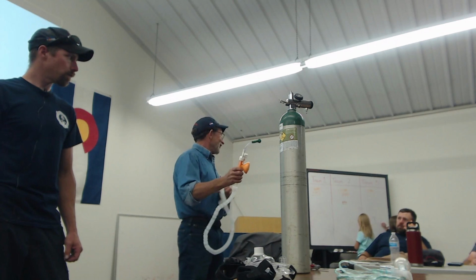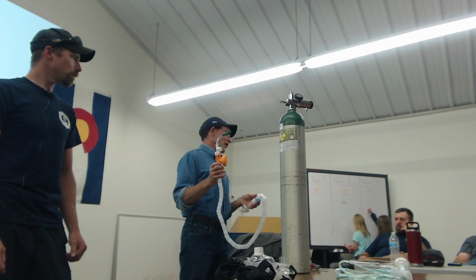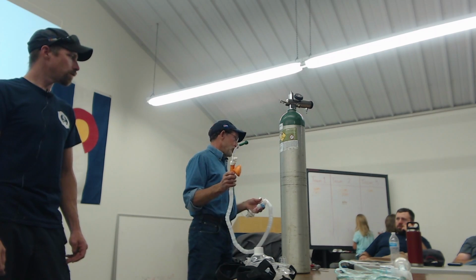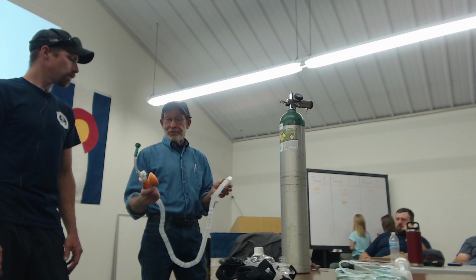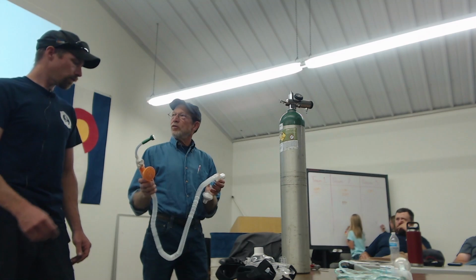Now at first, they're going to feel different, but that's mainly because of the pressure that we're having to coach them through. So the pressure is so important ultimately that it can make up for a drastic diminishment in FiO2. That's not to say that your patient may not get sicker and require 60 or 90%. Tyler, let's show them how we can coach people through this.